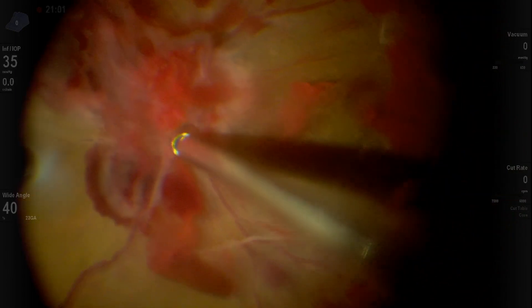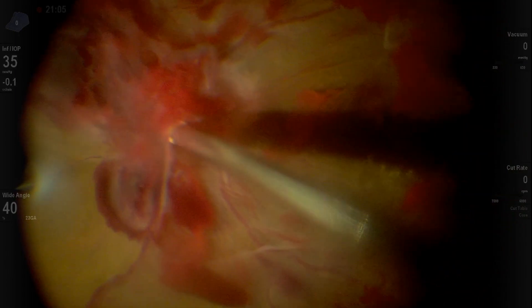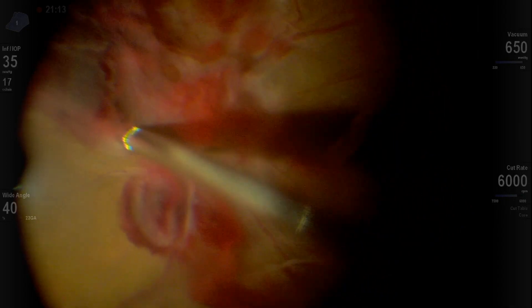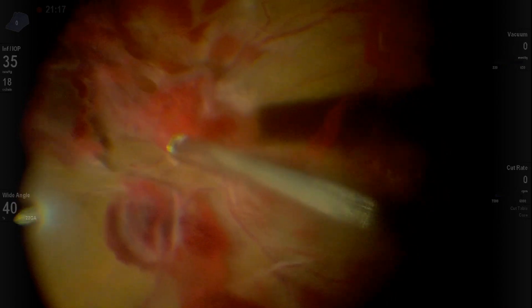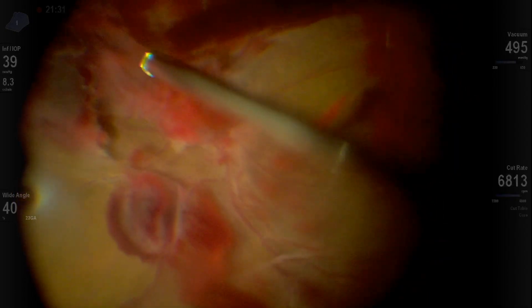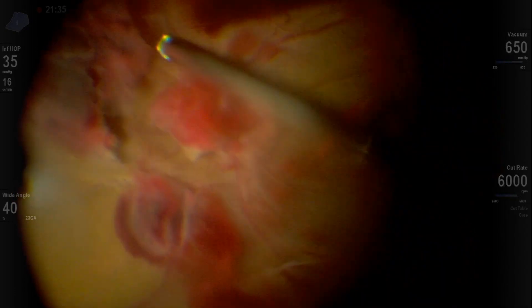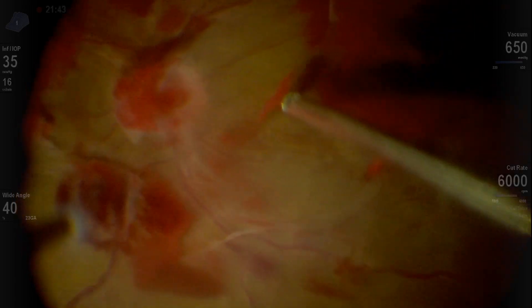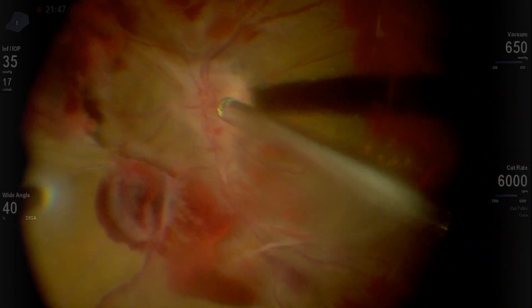You can see here now we're in business — we can lift up and then cut, and you can see where the retina is. So you commit, lift up, then cut. And sometimes you have to be assertive and cut with the port cutting back, depending that the membranes are more mobile than the retina, especially if the retina is flat.